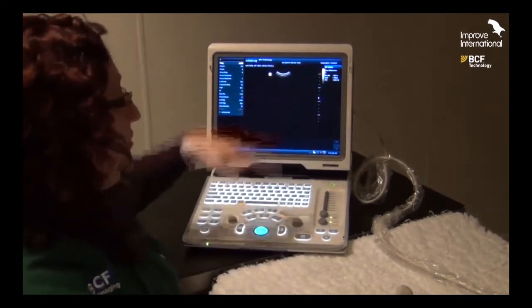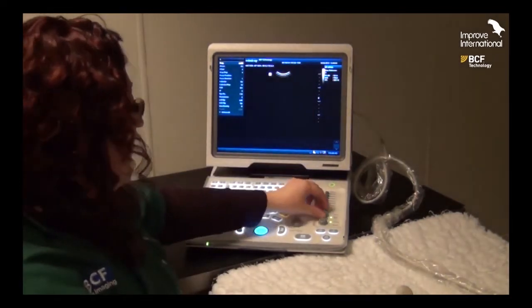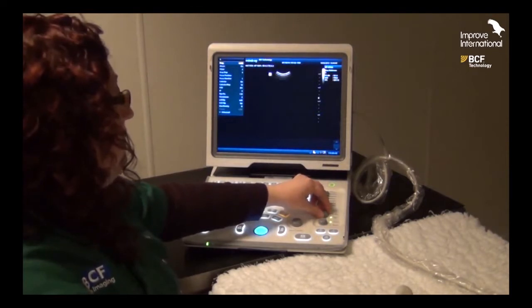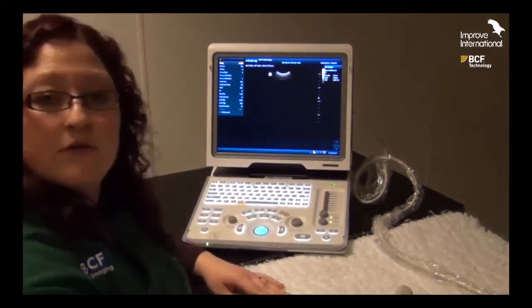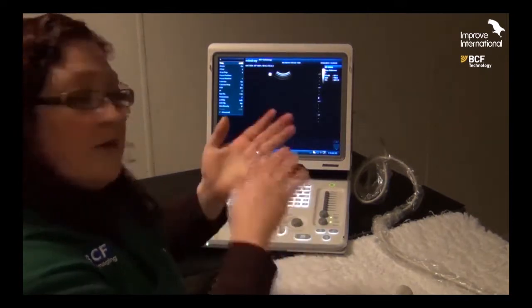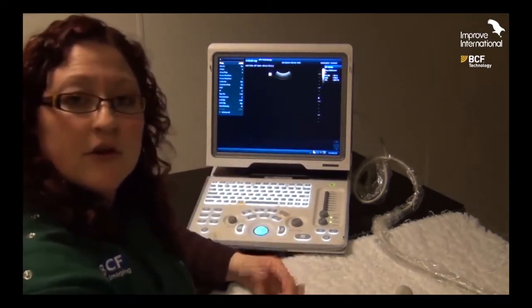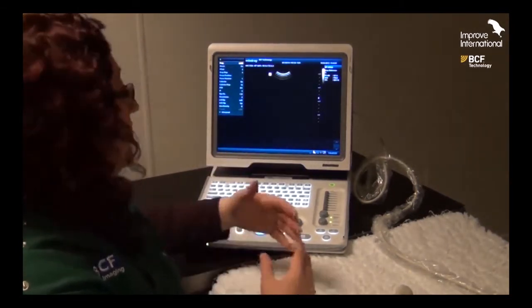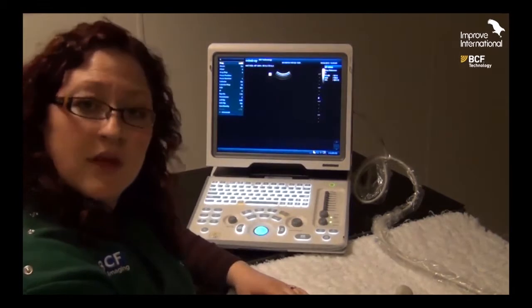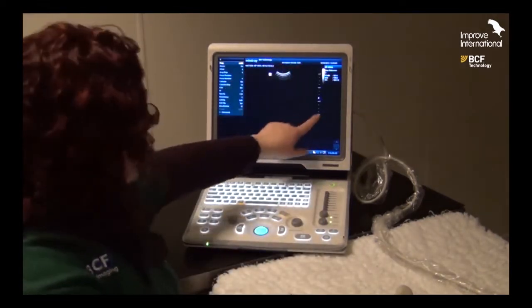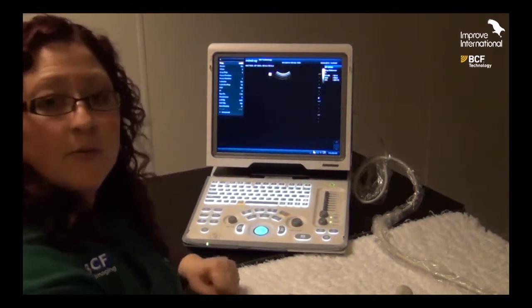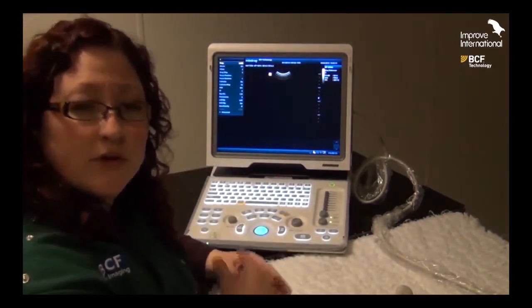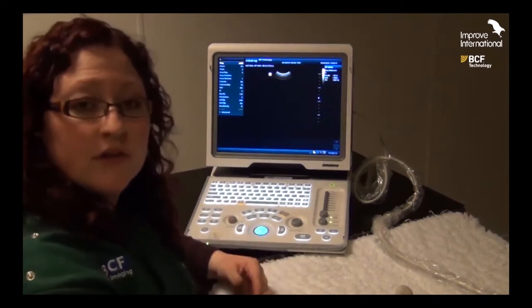On this particular machine, you can alter the frequency up or down. To reiterate: for things that are very superficial where you want a high degree of clarity or resolution, use a high frequency setting. For things that are lower down within the abdomen — corresponding to the bottom of the screen — use a lower frequency setting, acknowledging that you'll lose a little bit of clarity or resolution in the process.